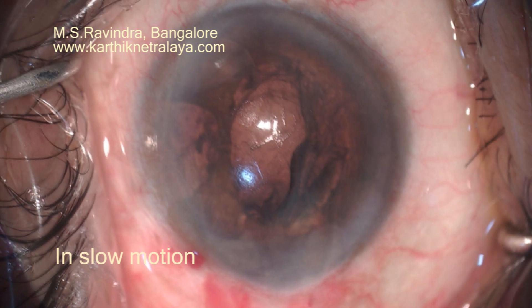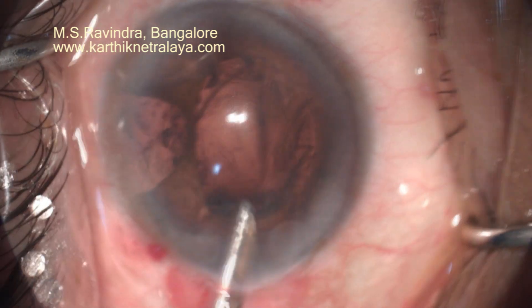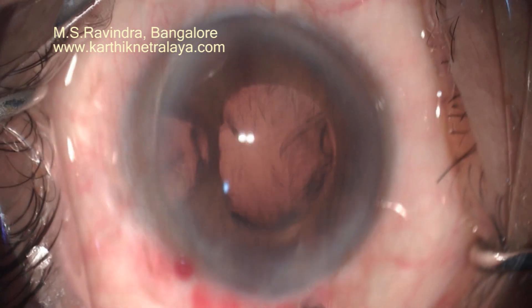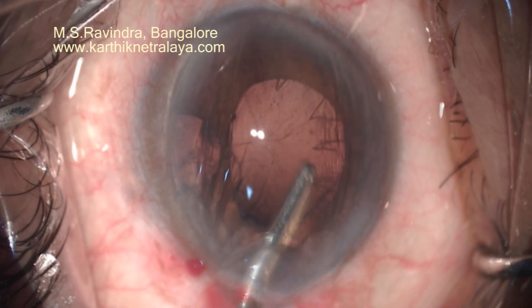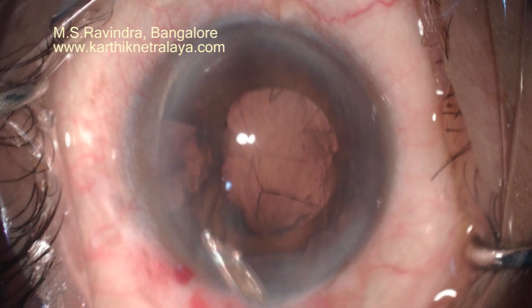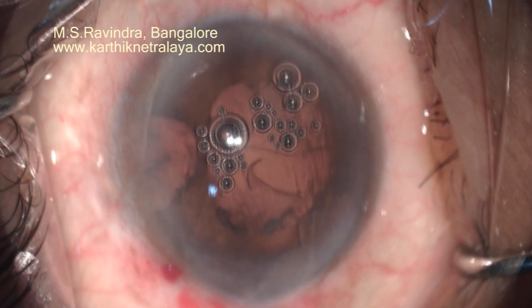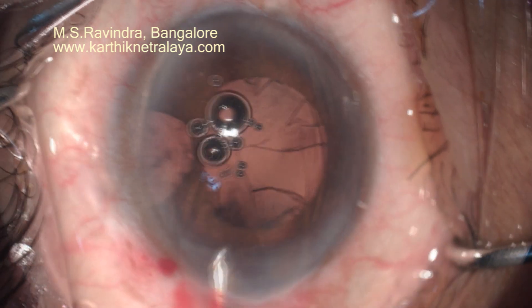A Simcoe cannula is used, mounted in a silicone bulb, so there is very controlled flow of fluid into the eye. Unlike when draining from a bottle — where there is no control — here the amount of fluid going into the eye is absolutely controlled by visual feedback as to what is happening in the anterior chamber. I control the inflow, I control the outflow. Flow rates are very minimal, vacuum is highly controlled by the fingertips, giving complete control of the fluidics and hydrodynamics of the events happening in the eye.